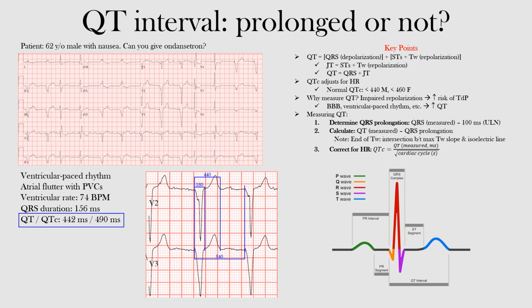A common question that you may encounter clinically is whether or not the QT interval is prolonged and whether certain medications may be administered or not. In this lecture, we're going to look at how to determine if it's safe or appropriate to give a patient a medication that may be QT prolonging.